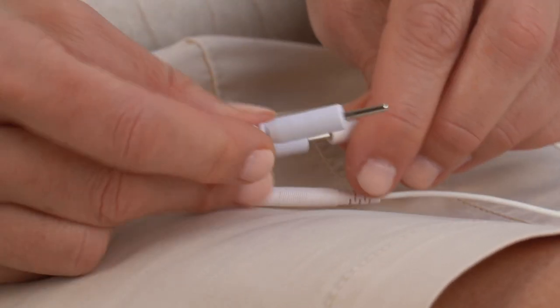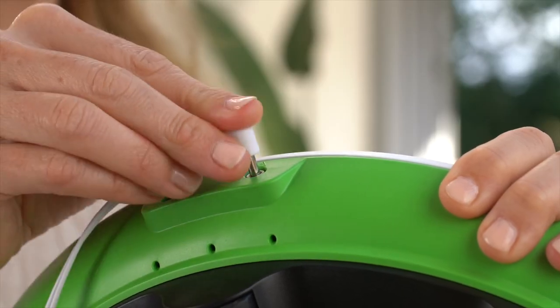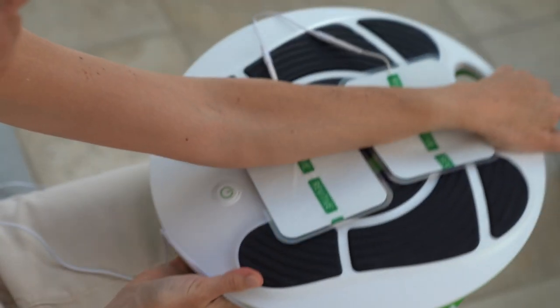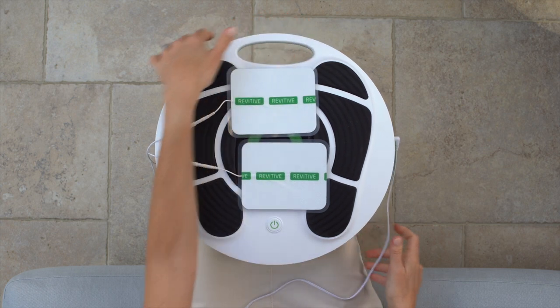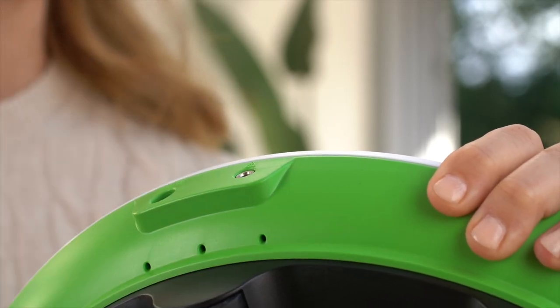First, attach the ends of the arthritis pads to the arthritis pad cord, then plug the other end of the arthritis pad cord into the opening on the side of Revitive. Be aware you won't be able to use the foot pads while the body pad cord is plugged in.